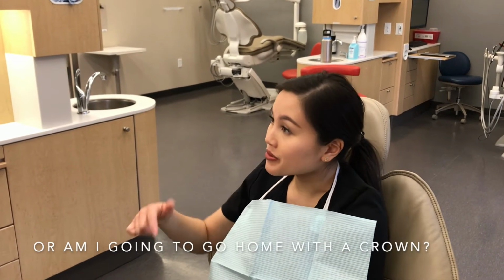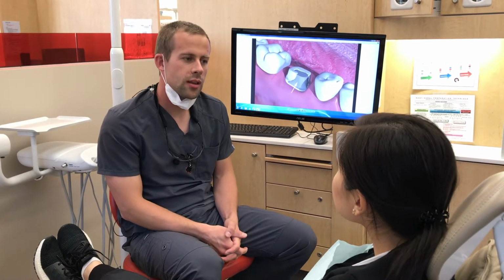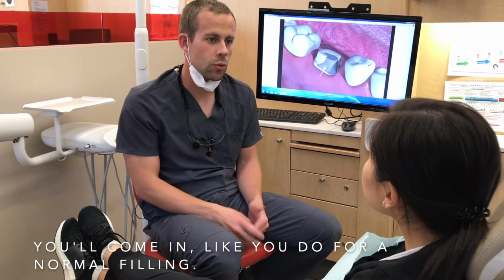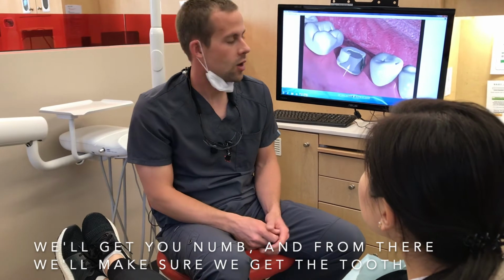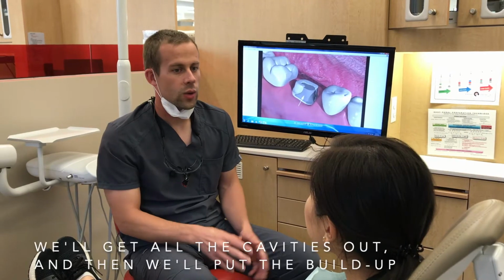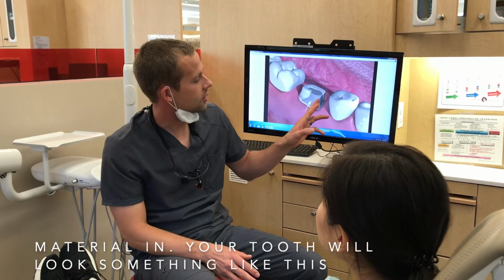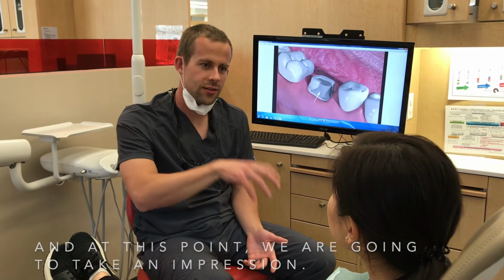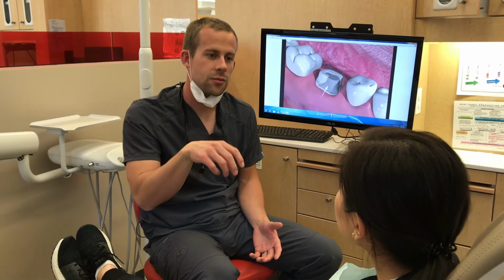Or am I gonna go home with the crown? That's a really good question. So let me tell you how the appointment will work. You'll come in like you do for a normal filling. We'll get you numb, and from there, we'll make sure that we get the tooth looking pretty much like this. We'll get all the cavities out, and then we'll put the buildup material in, and your tooth will look something like this. And at this point, we're going to take an impression so that the lab knows the design that the crown needs to be made to.